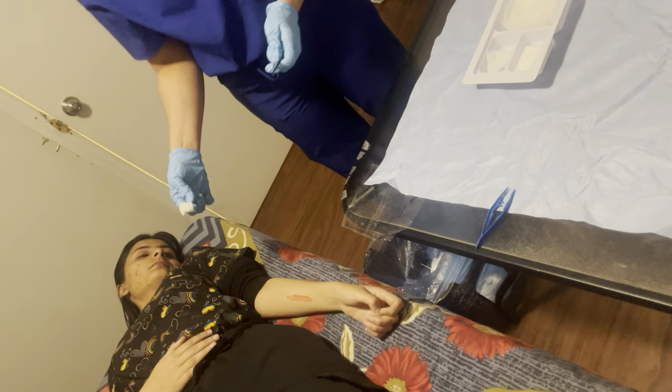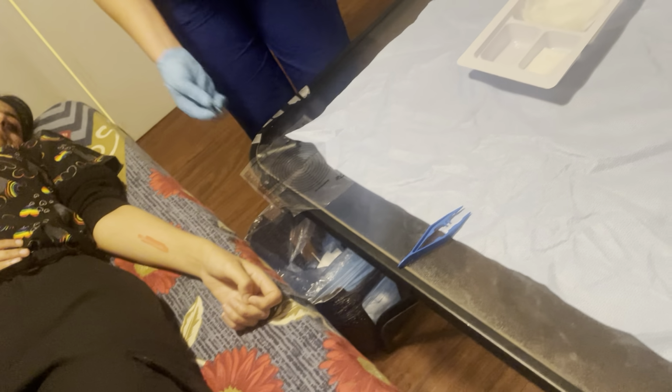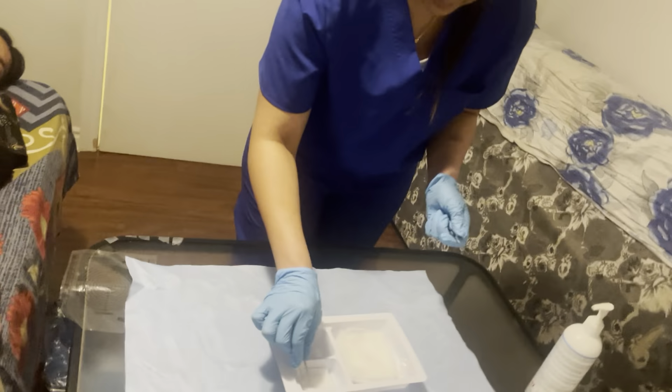Now I'm going to make another dumpling, squeezing it off, and again head to toe to the area that is closest to me, so in a single stroke, and discarding it off. So this is the third. This third dumpling is for the area from head to toe along the midline in a single stroke and discarding it off. Now we are going to pat dry the wound.